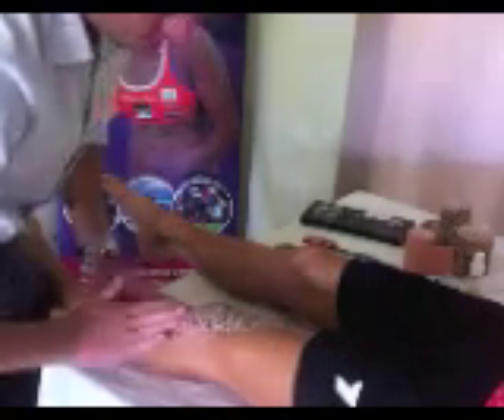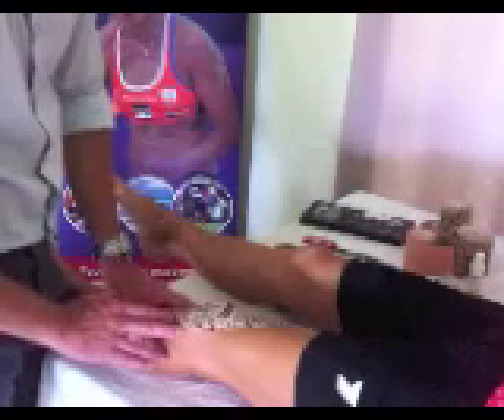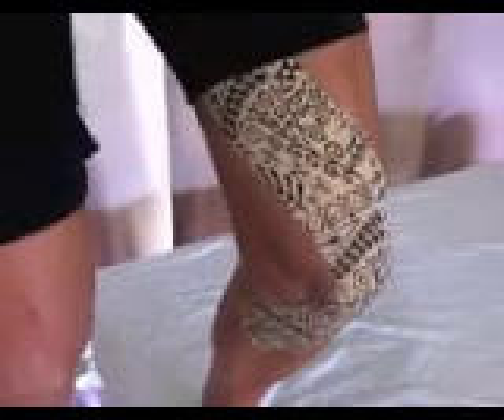Because this sits anterior to the axis of the knee joint, it will stretch when going into flexion and recoil as they come back into extension, doing some load absorption through the quad, patellofemoral joint, patella tendon, and musculotendinous unit — potentially taking some load away from the patellofemoral joint. As they bend up, this is going to hook in under the outside and resist that lateral motion of the patella. The dynamic tape absorbs load in flexion and reintroduces it back into extension, and because of the lateral positioning of the power band it will tension under flexion and resist lateral translation.